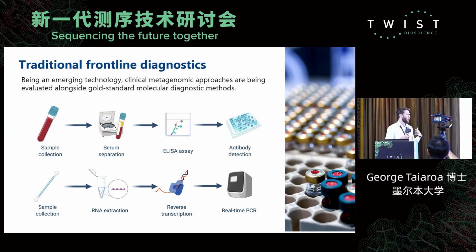And so what we are looking to do at the Doherty Institute is to use nucleic acid-based tests, things in line with the bottom here, to characterize pathogens and to detect them in different or more useful ways. So I'll outline a few of those now.